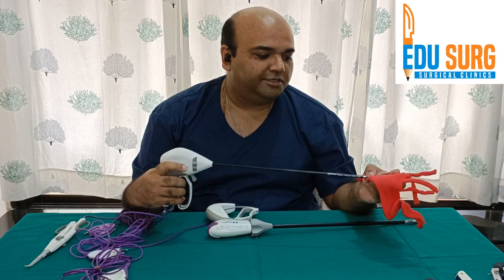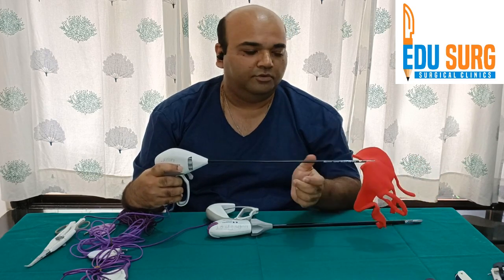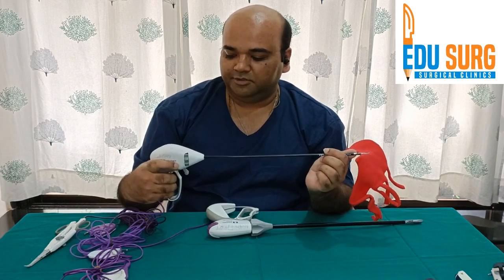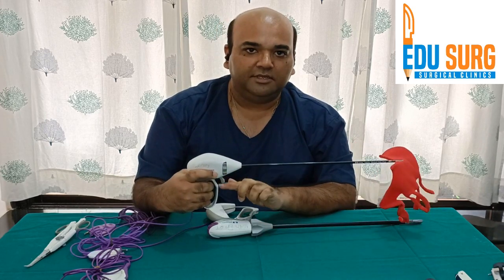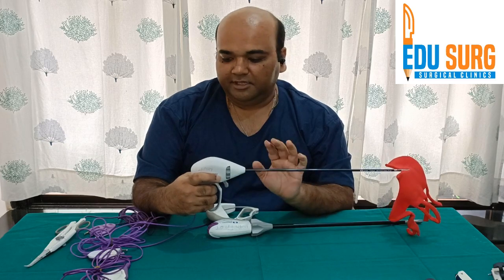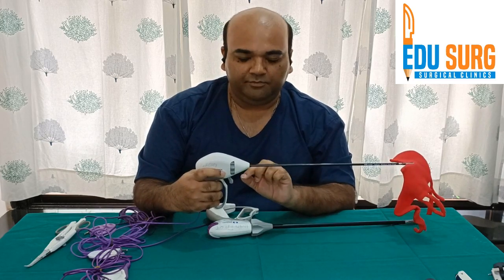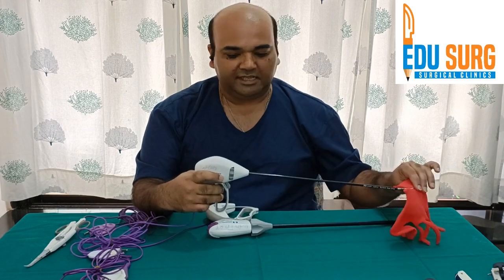What you do is hold the tissue with the jaw. Then you lock the tissue. In the 5 mm variant of LigaSure, the locking and the activation of bipolar both are in this handle only.